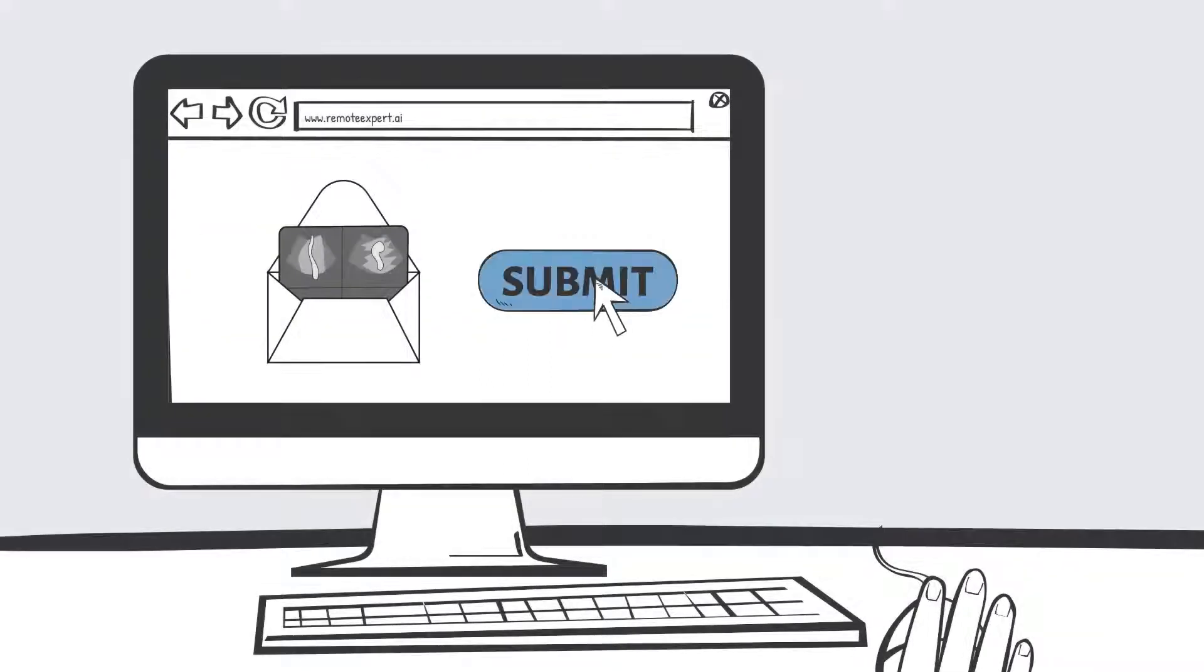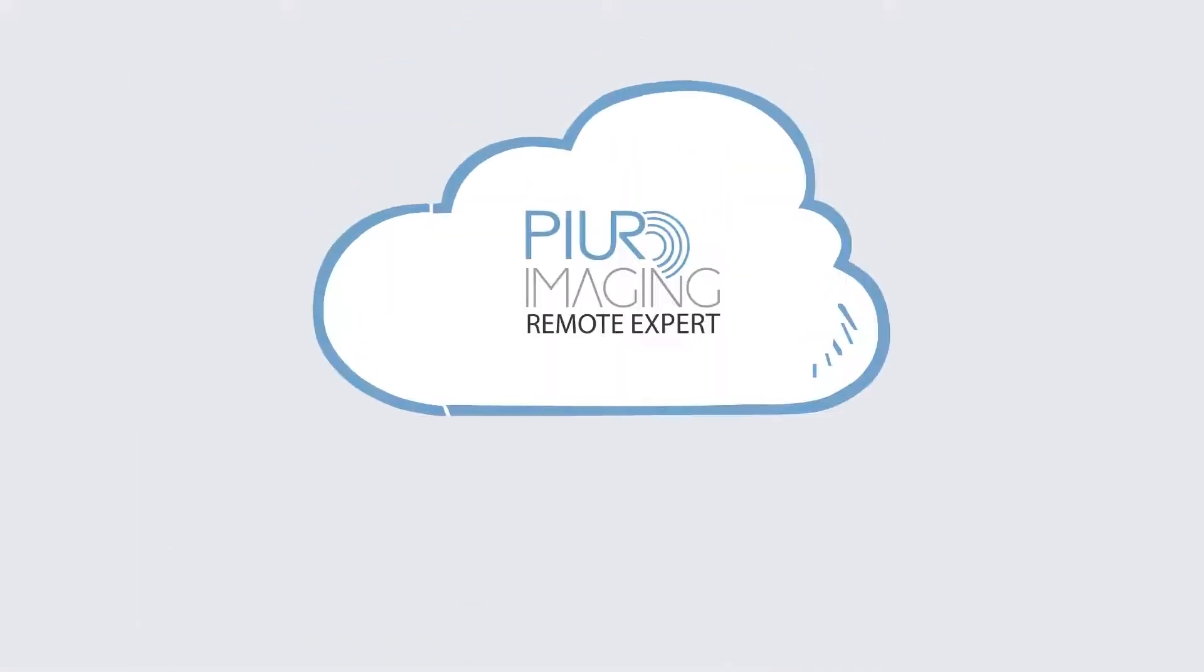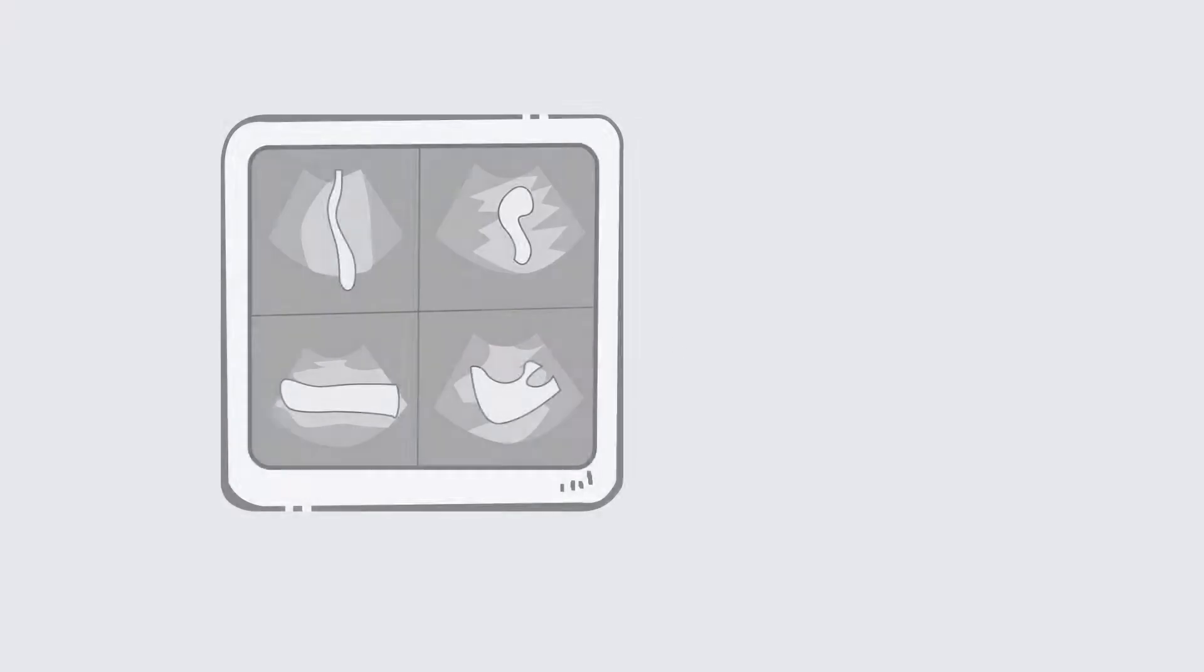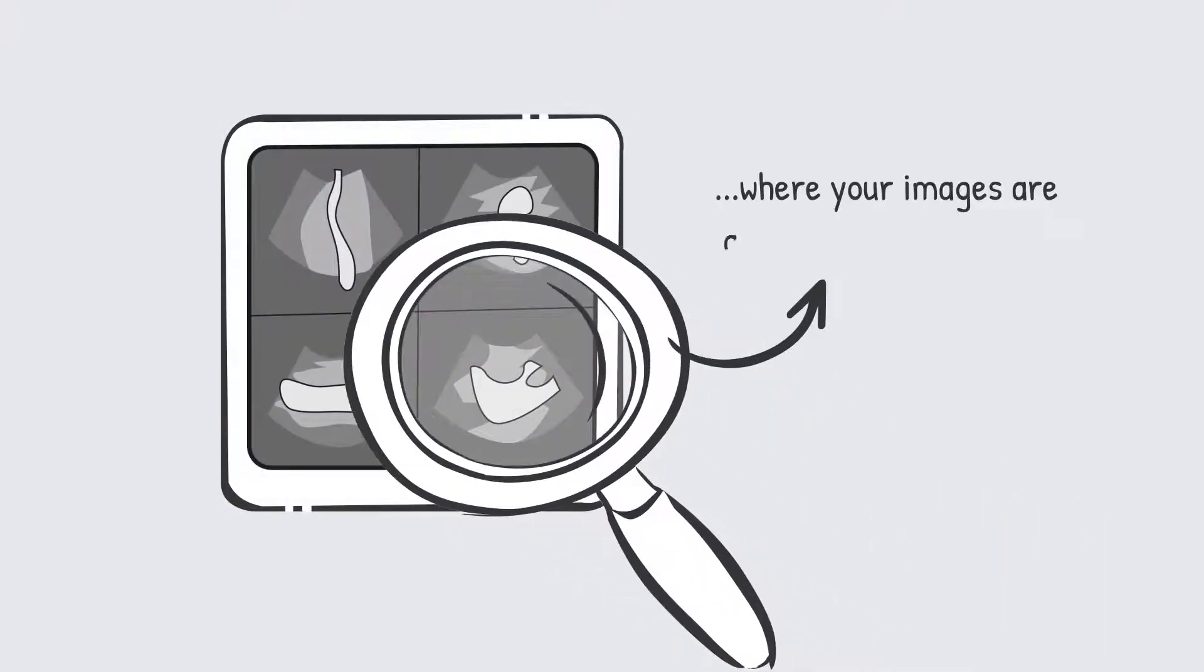It only takes a few clicks to submit your data to our cloud platform Remote Expert, where your images are automatically analyzed.